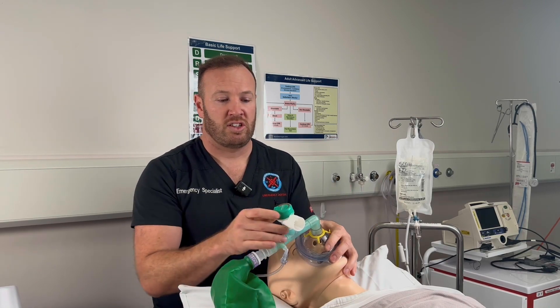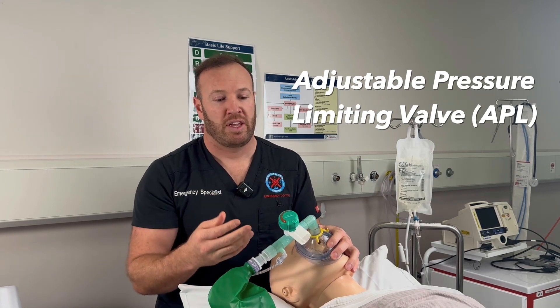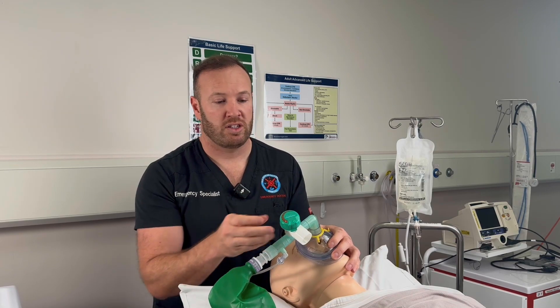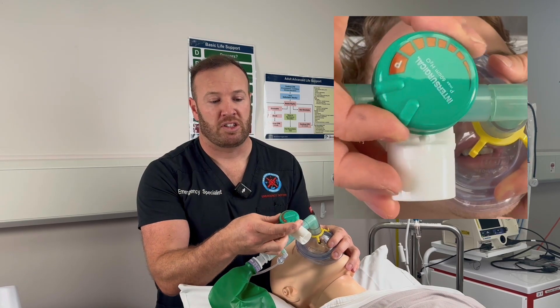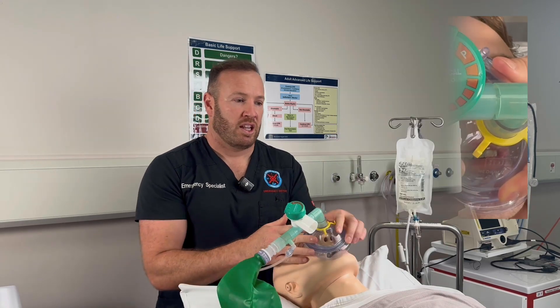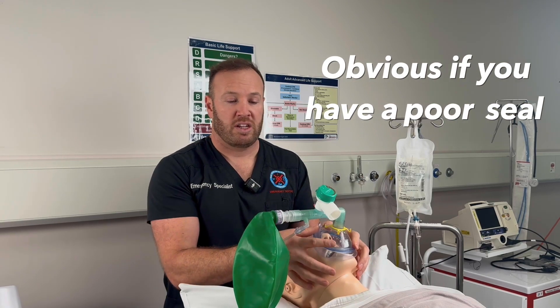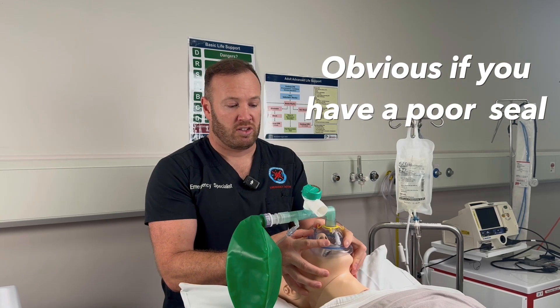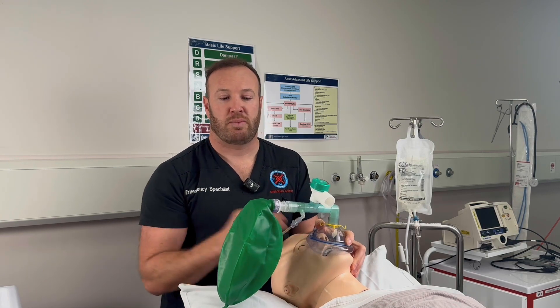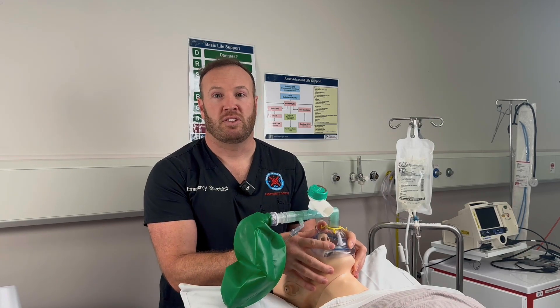Another advantage is the built-in APL valve — although technically different to a PEEP valve, we can treat it a bit like one. In a spontaneously breathing patient we want nothing to impede expiration, so we keep it completely open, but by dialing the valve up a half to a quarter turn we can put a bit of PEEP into the system. There is also direct feedback as to whether our seal is any good. Because this is a semi-open circuit, it requires a complete seal around the patient's mouth for the bag to remain inflated. As soon as we lose that seal, the bag is going to deflate, giving us a clear indication that we haven't got an appropriate seal.